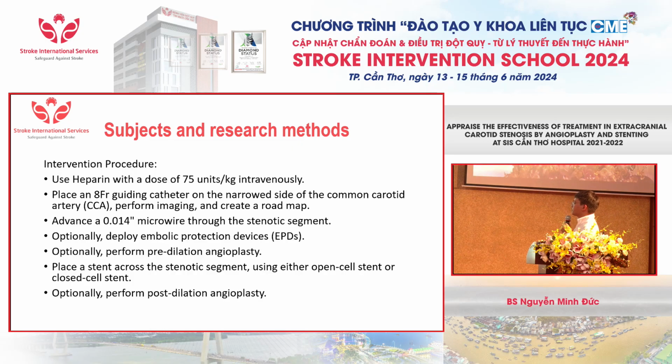For the intervention procedure, we use heparin. We place an 8F guiding catheter, super-selected with a 014 microcatheter and microwire through the stenosis segment.